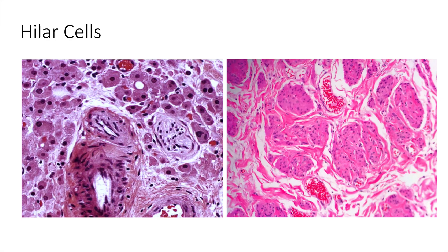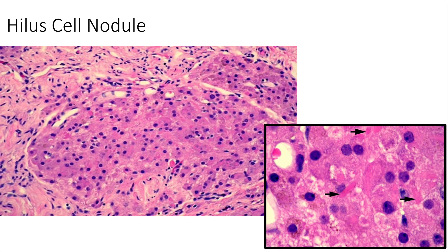Another benign cell you'll note in the ovary is the hilar cell. These are morphologically identical to Leydig cells of the testicle and are found, as the name suggests, near the ovarian hilum. Mild hyperplastic changes in these cells are more common in postmenopausal women. When these cells aggregate together to form small nodules, they're known as hilar cell nodules. Reinke crystals are present in some hilar cells, as pictured on the bottom right with the arrows.